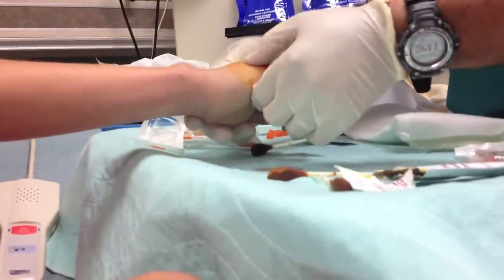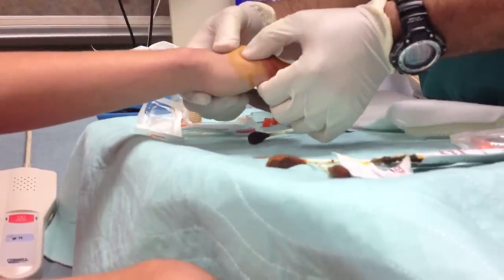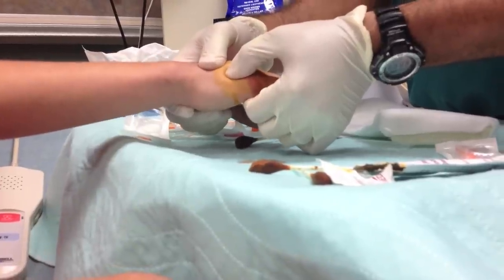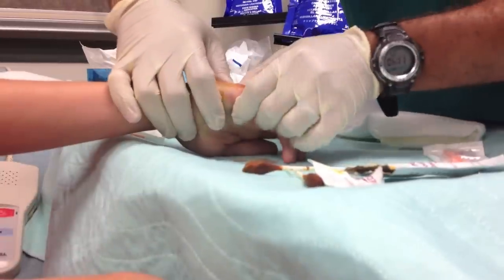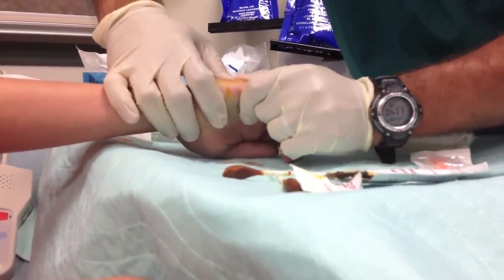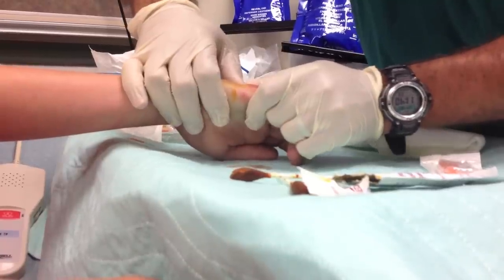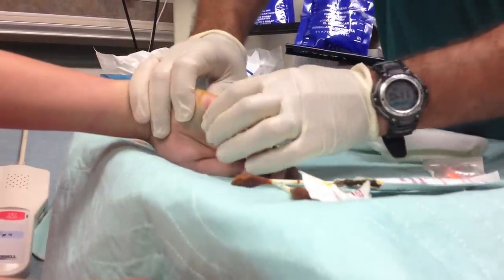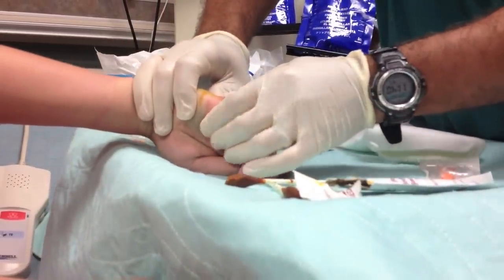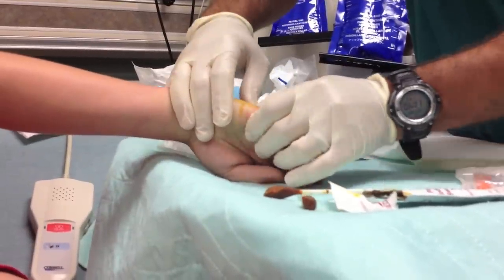Feel numb? It's numbing up a little — I can push it. It hurts a little? Sure. So basically what you want to do is apply some traction and then use the thumb to kind of push it back in. I try to overdo it because the last thing you want is to do it partially, get an x-ray later, and find you didn't really do anything. So I overdo it — I push as hard as I can the other way.